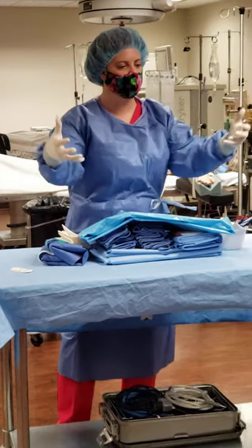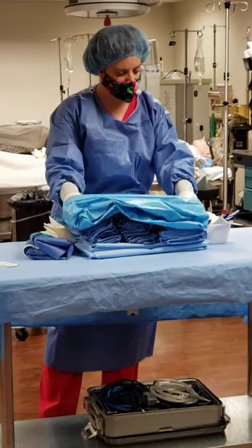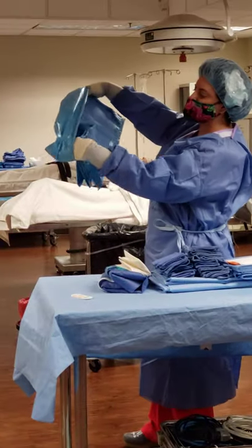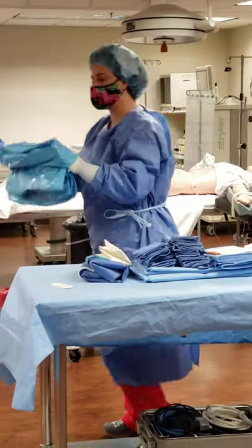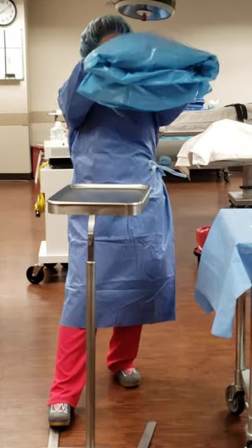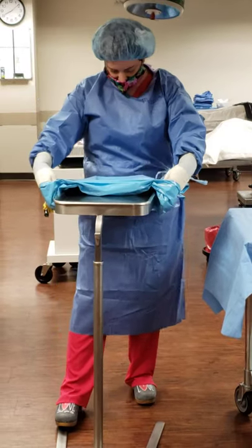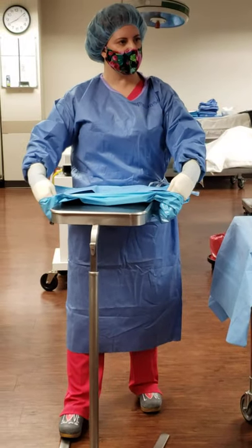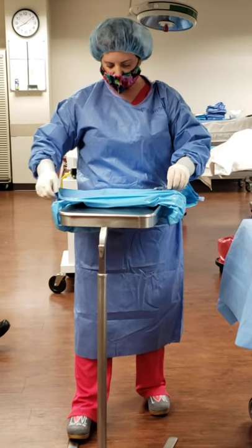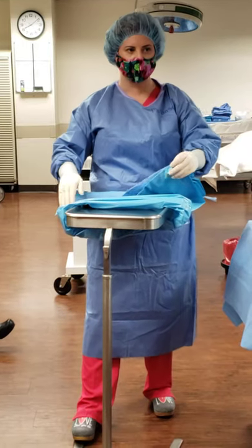So I kind of just get around the edges and hold on to that a little bit. You're going to keep your hands under here — I have my fingers holding it like this. You're going to get your foot on your mayo stand. Put the mayo stand in that little opening there, the little mouth. Then once you get it started, you can belly up to your mayo stand. That keeps this tail from falling down there. If the tail falls, it's out of play.